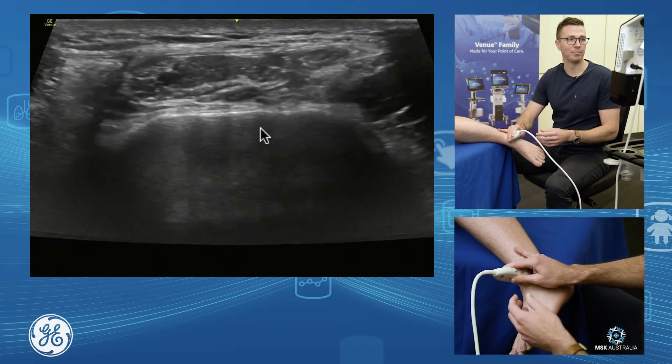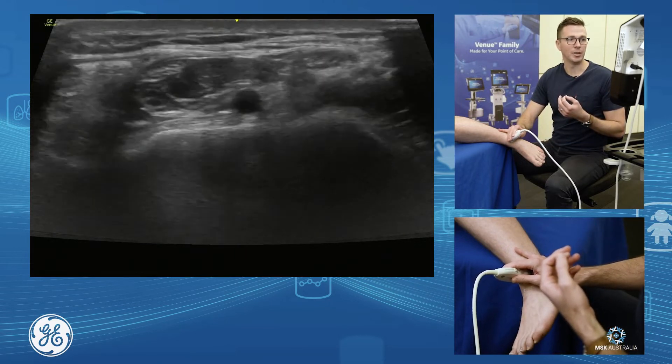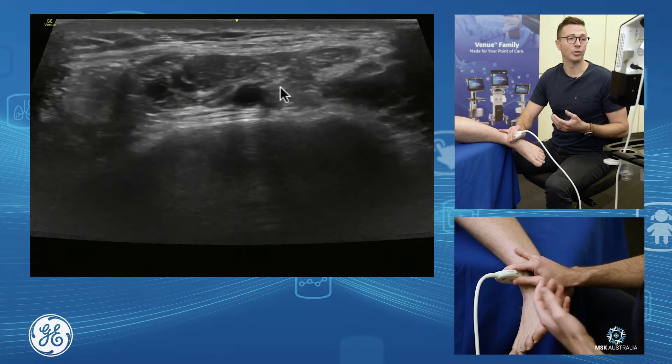— you'll pick up your dorsalis pedis in through here, with its veins on either side. And our deep peroneal nerve sits just adjacent to your dorsalis pedis.